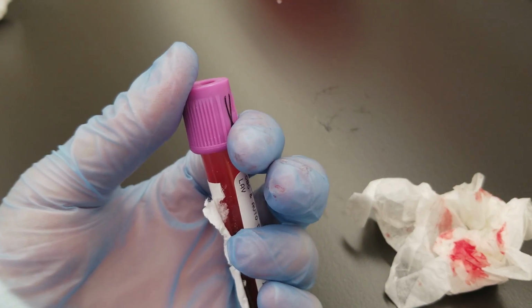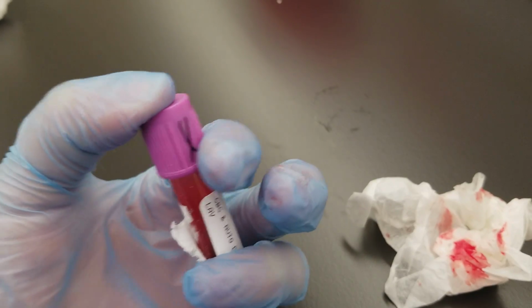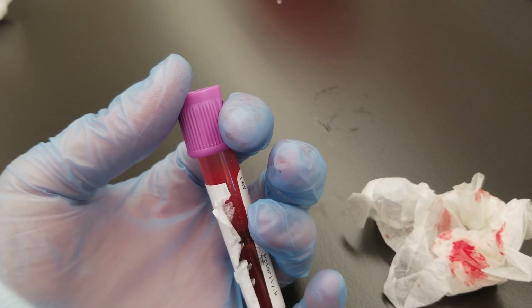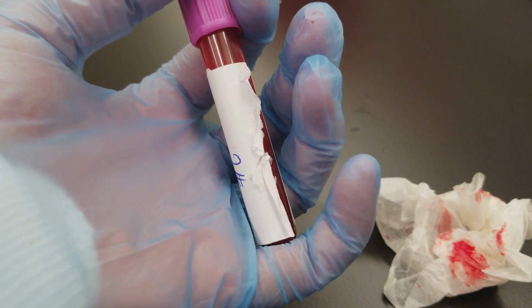So make sure that before you put out or verify definitive results, if something looks crazy, like the platelets are really low, you can clot check it and see if it's actually clotted.